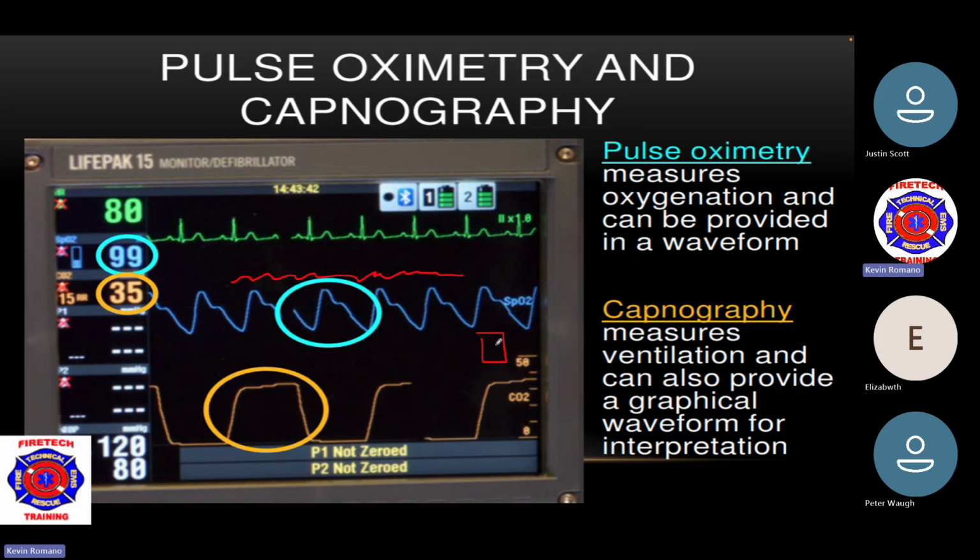In there, you'll have something called sensitivity. You can change your sensitivity level from normal to maximum, and that'll give it more infrared reading. Therefore, if you have a patient with cold hands, things like that, you might actually get a more accurate reading if you change the sensitivity levels. Right? Most of the X Series monitors have that. But that's going to be our waveform looking for the SpO2.